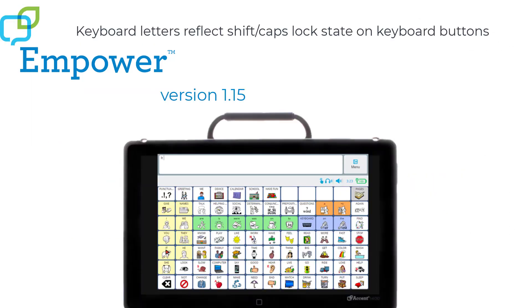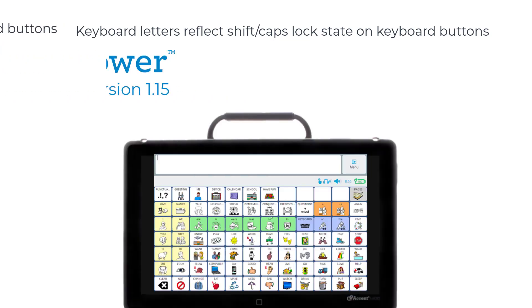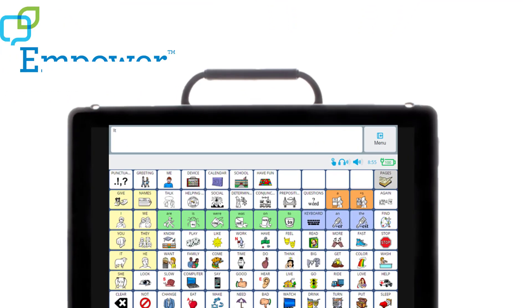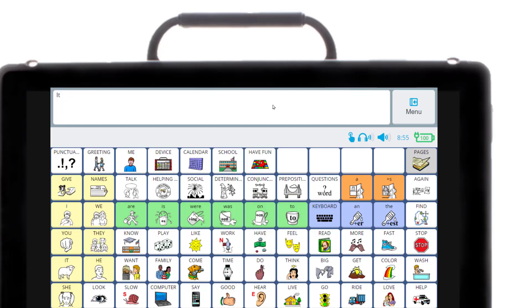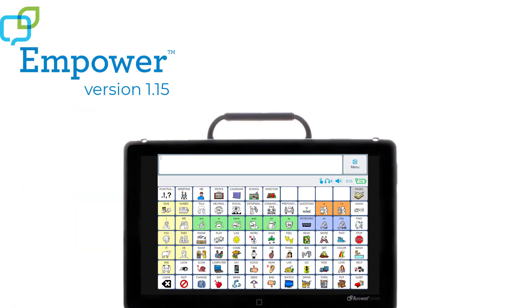Now it's much easier to tell if your caps lock or shift key is turned on in your keyboard. If your caps lock is inadvertently turned on, then words in your core vocabulary that can also be abbreviations will be pronounced as the abbreviation when they are spoken from the message window. Let's see what that looks like. First I go to my vocabulary and I select the word 'it'. You'll see in the message window that the word 'it' is spelled with a capital I. When spoken from the message window, I also hear the word 'it'.